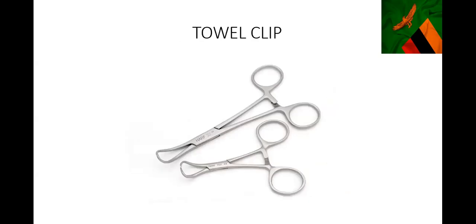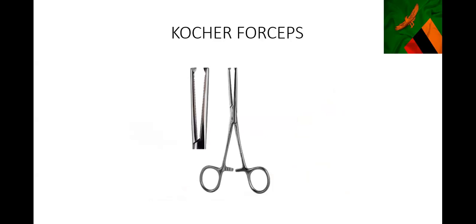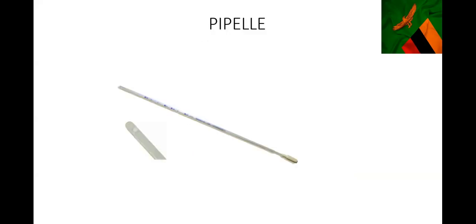These are just towel clips. When we drape the patient, we don't want towels moving around, so we use these clips to hold the towels in place on the patient. This is a Kocher's forcep - something we use to hold onto tough tissues like vaginal tissue. We use it for artificial rupture of membranes and to hold onto the vault of the uterus during hysterectomy.